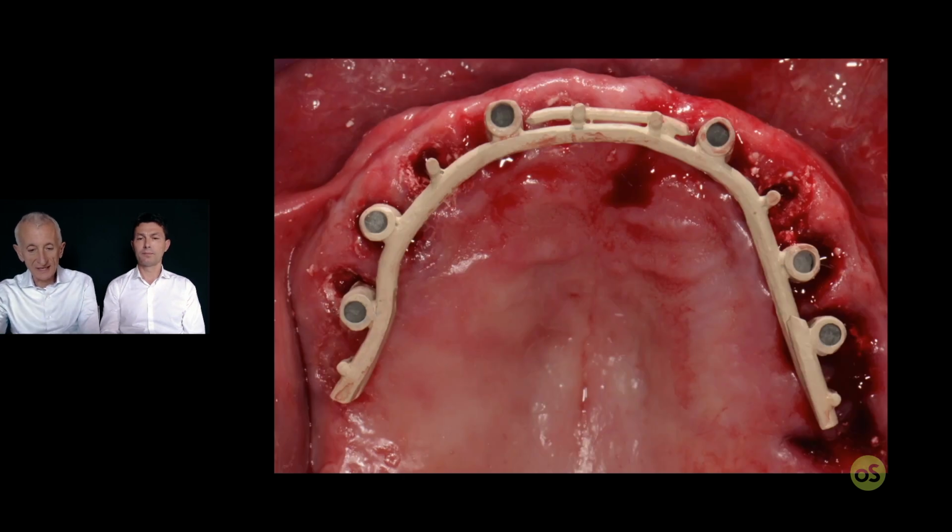So this is what I get from Gianluca. I just press this, and on the 6th implant, this is an implant level with an internal connection, so no screws are necessary to retain the framework. The framework is stabilized by the index.